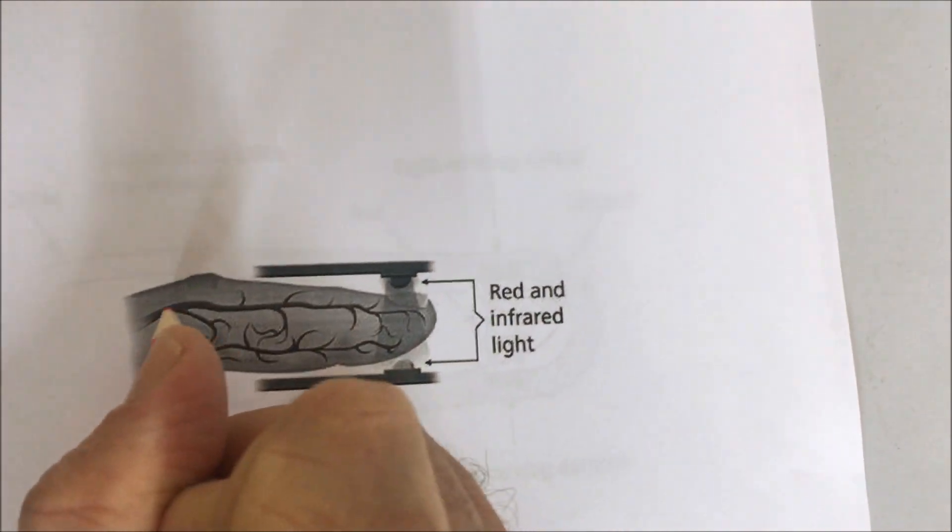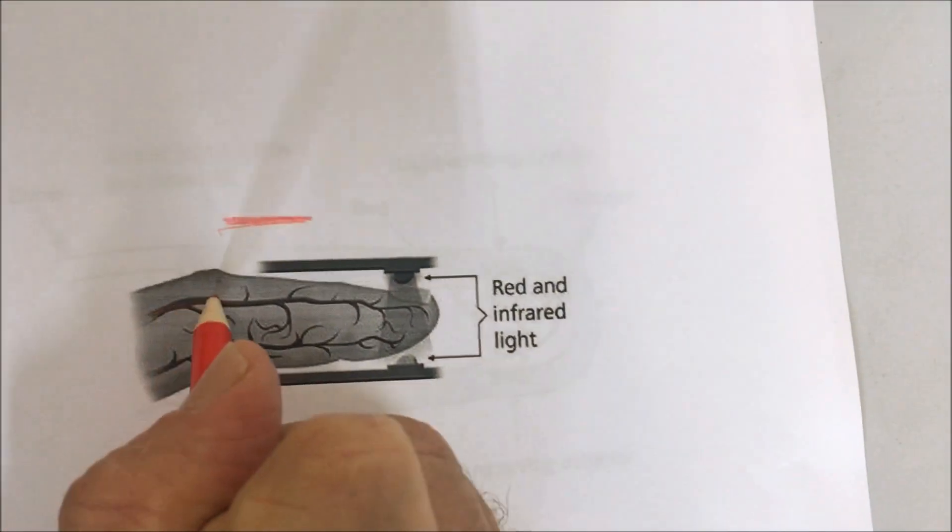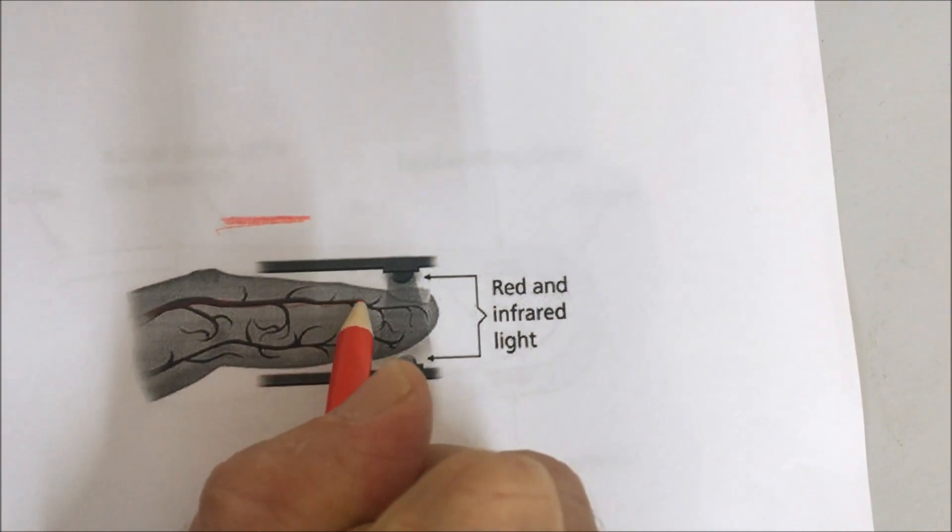So what an oxygen saturation monitor is doing is actually looking at the difference of how much infrared light and how much red light is being absorbed. When oxygen is pumped out of your heart through your arteries, the blood is red and it goes through the arteries all the way to the tissue.